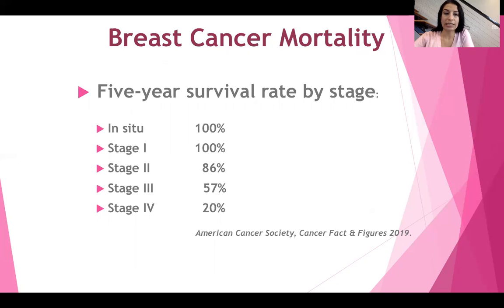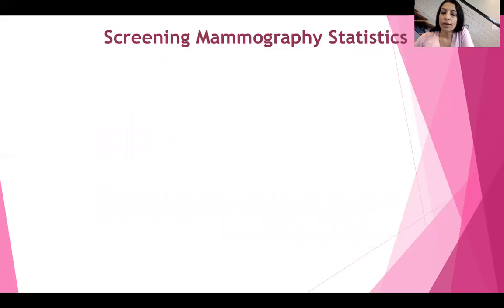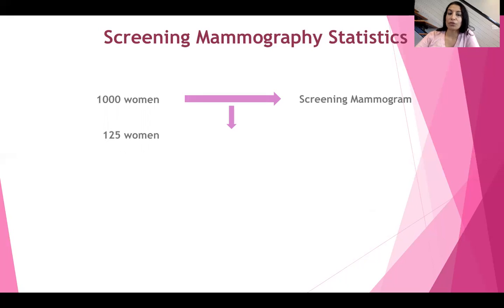always early detection. So, you hear about the screening controversies, you hear women talking about callback examinations, and here are just some statistics that I want to show you for what screening mammography does over a population. So if 1,000 women get screening mammograms, about 125 of them will be called back. So the goal callback rate is below 10%, but we do know that depending on communities or baseline screening, it can be higher. So about 125 women will be called back for additional imaging.